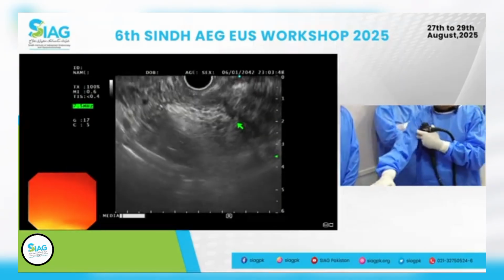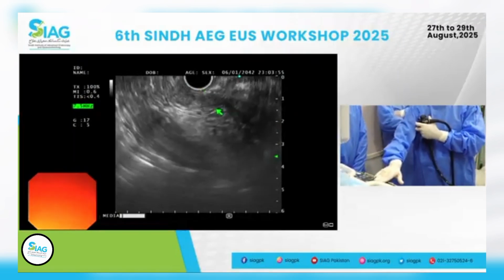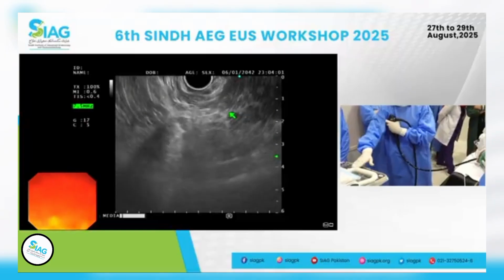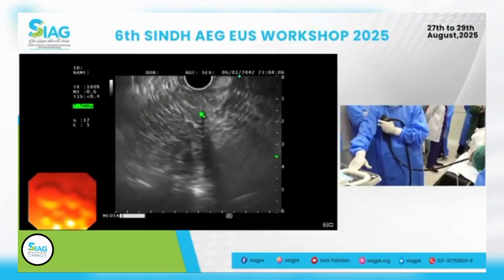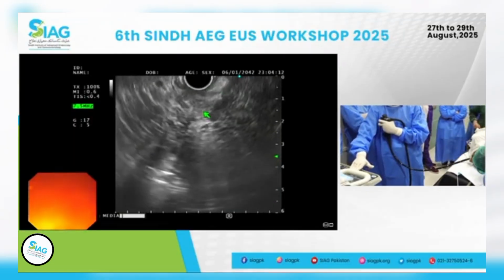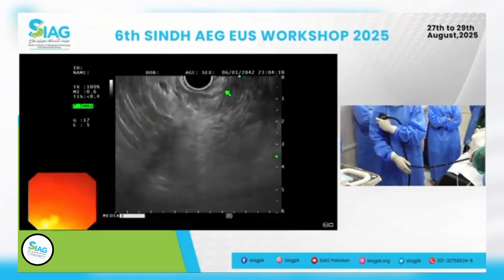From here, the stent is a little bit into the duodenum because the duodenal lumen is here. So what I'll do, those air columns in the stent, I'll move it a little bit away from me so I can see the papilla. So right here, stent is right there. You see the duodenal lumen. This is the wall of the duodenum right here. So ampulla is right where the stent is, right there. This is the ampulla right here. Because I see the wall, muscularis propria right here falling down.